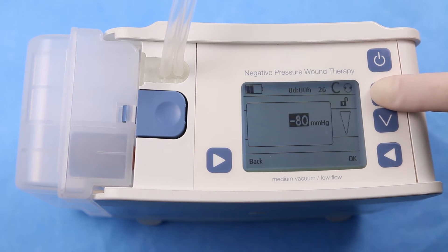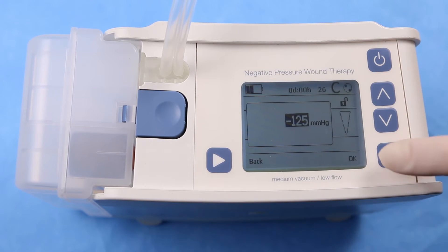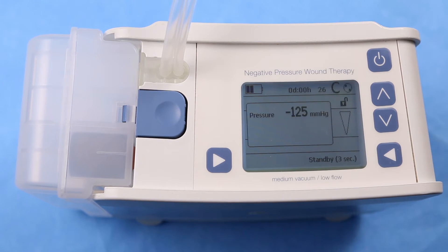The up and down arrows may now be used to change the pressure level. Set the new pressure level and press the bottom right button next to OK to confirm the entry.